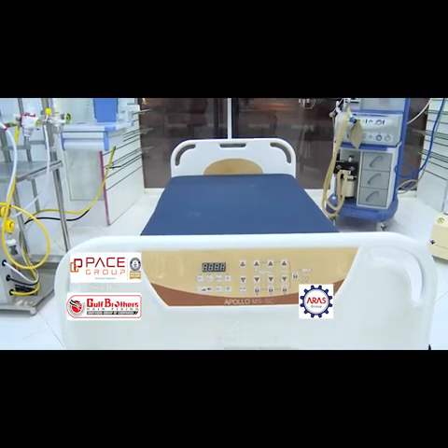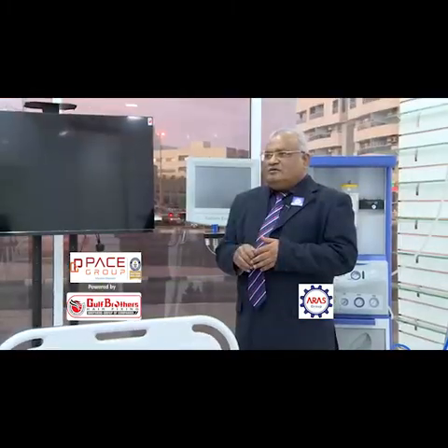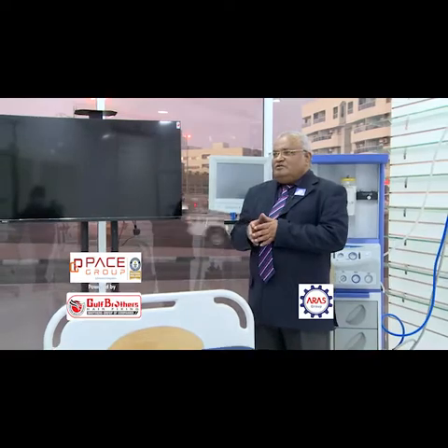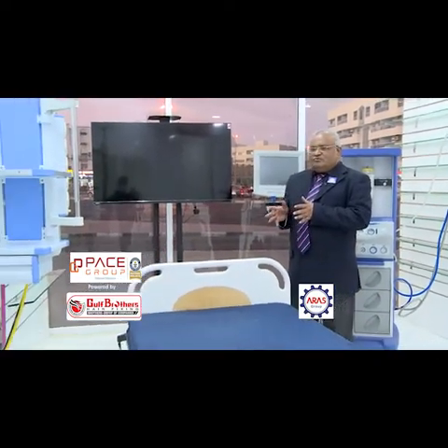But in the operation theatre, you need all the facilities: oxygen, nitrous oxide. In maternity and delivery, you need Entonox. Then you need medical air, then surgical air, then vacuum, then the anesthetic gas conveyance system. All this is used for the operation theatre.